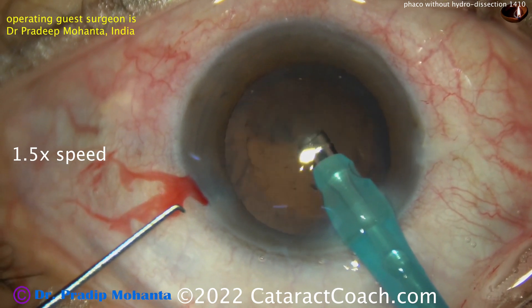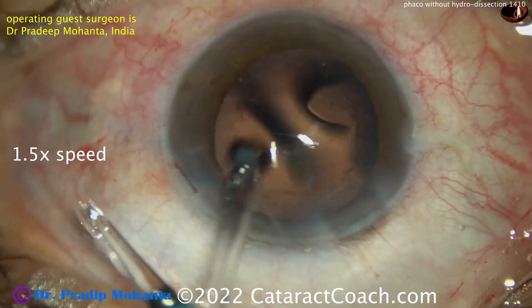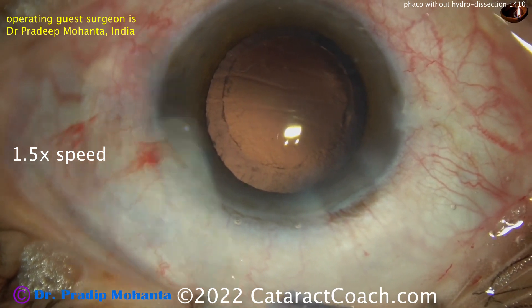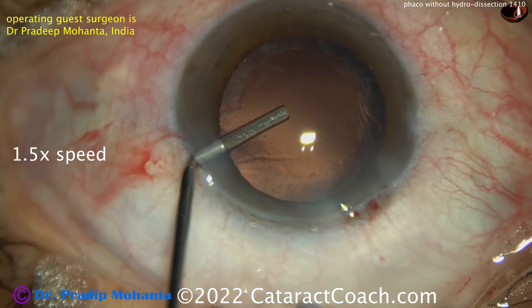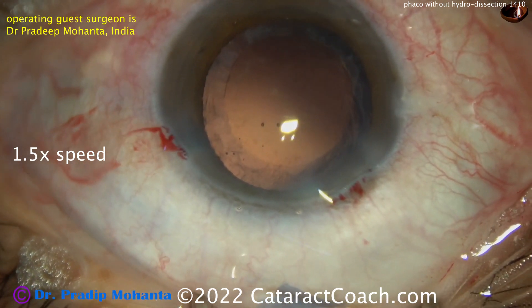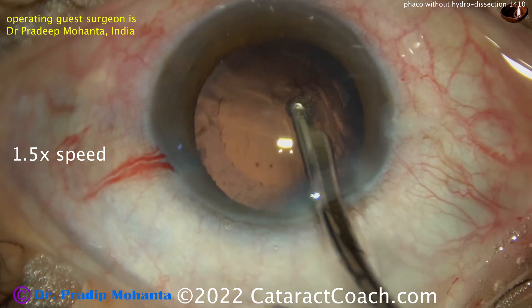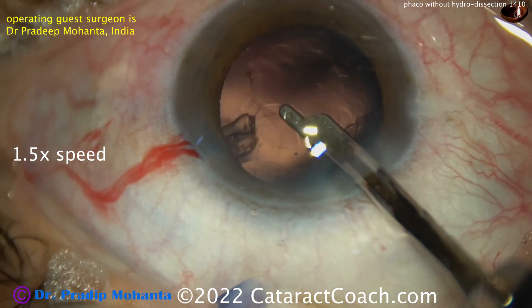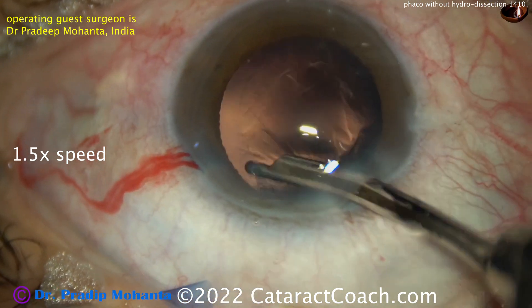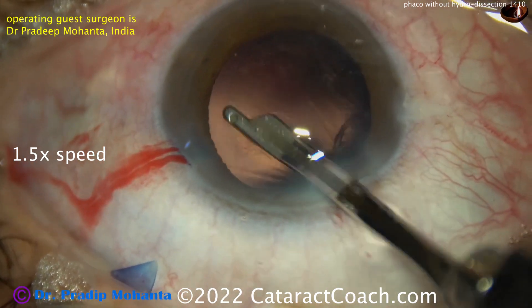Coming out with the second instrument actually helps with fluidic balance. Remember there are two sources of fluid outflow — what you aspirate through the phaco probe plus what you lose to the incisions — whereas there's only one source of inflow: the balanced salt solution infusion line. Here the capsular bag is being inflated with viscoelastic, and then a Simcoe cannula is used to remove the lens cortex, which is cleaned up pretty nicely.